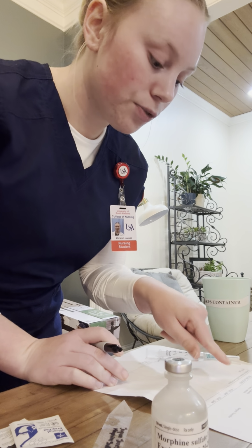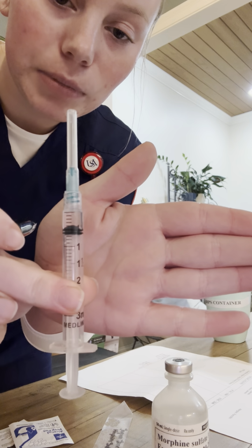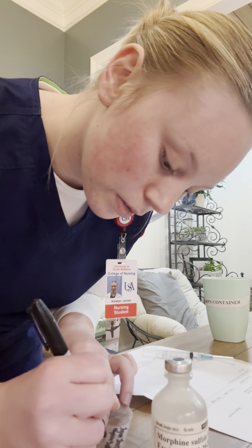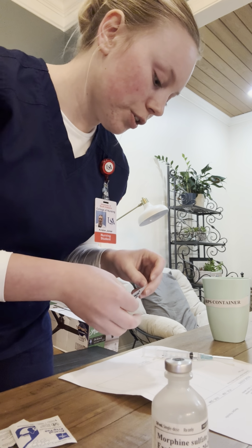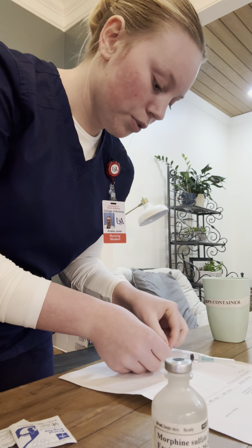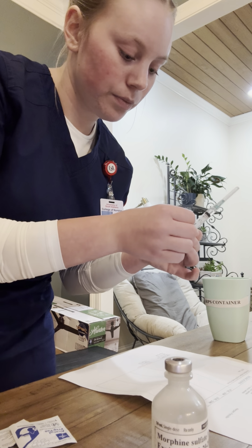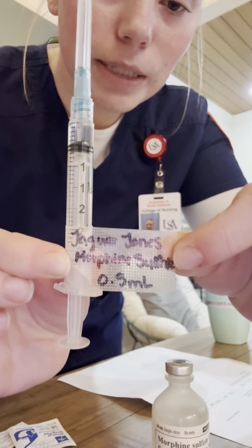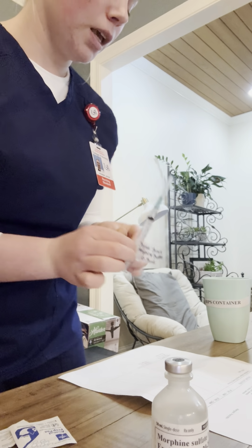And our dose is 5 milligrams, which is also 0.5 milliliters, and we have 0.5 milliliters in our syringe. So now we're going to apply this label to the end of our syringe to correctly document this. All right, so our syringe is correctly labeled. This is the correct documentation for this syringe as well.